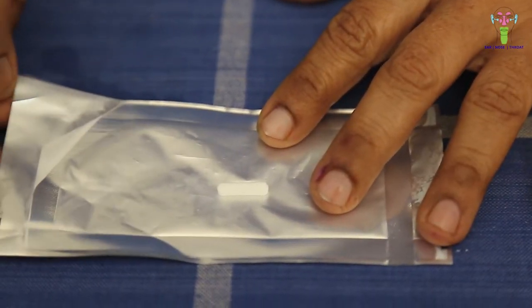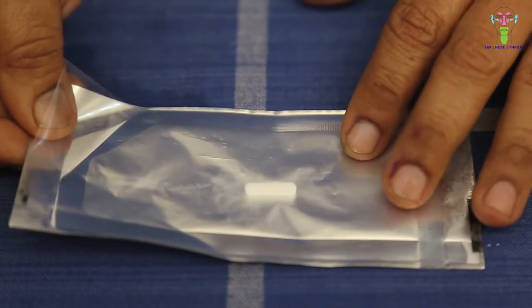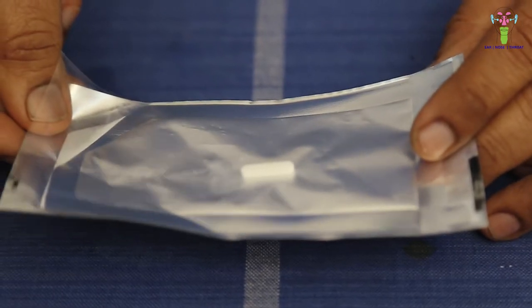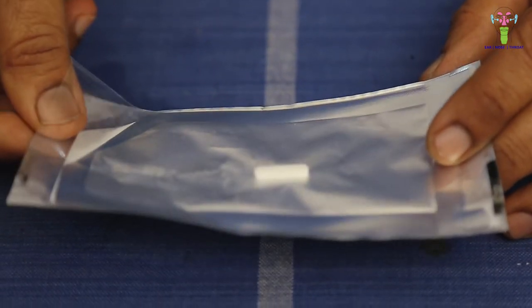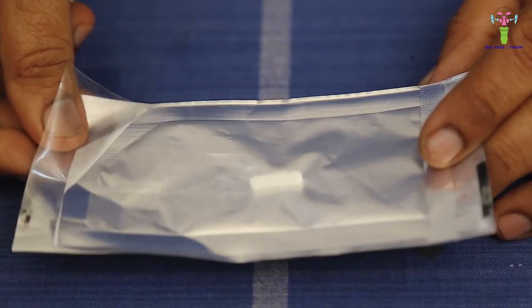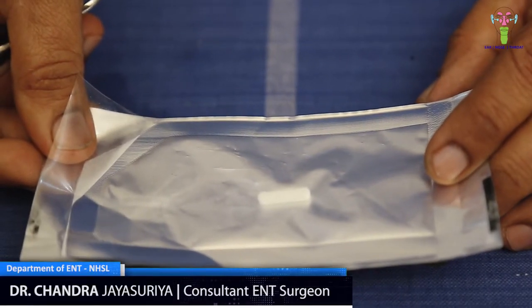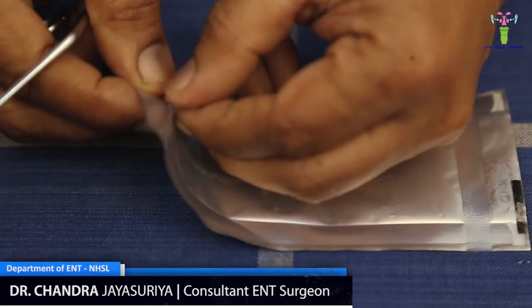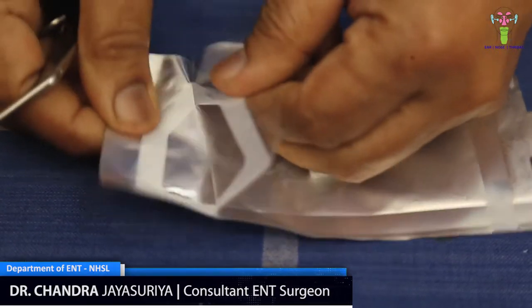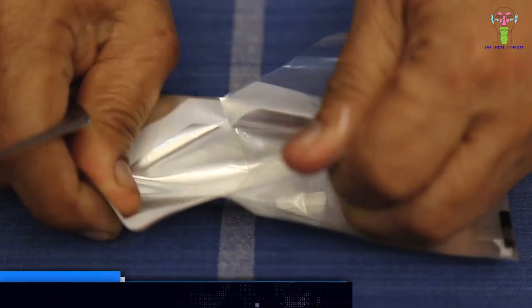This is a small wick which can be inserted into the ear canal. Though it is very small, it will be enlarged when we inject ear drops or saline. We can open this sterile pack and hold this with the crocodile forceps.